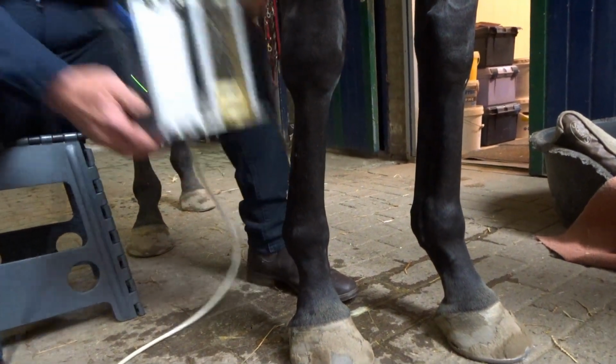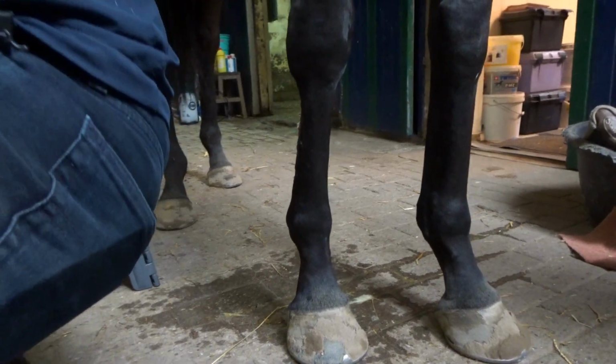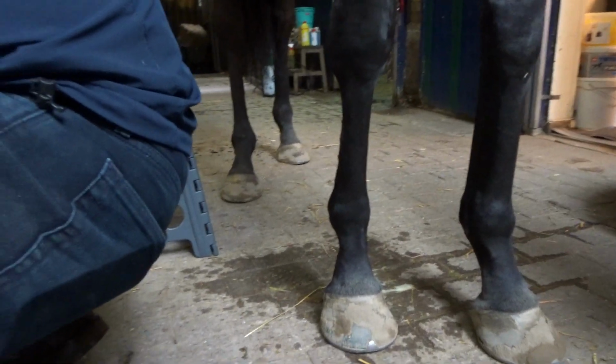And the horse has to stand completely still, Henk? Yeah, 40 seconds, no movement. Sounds short, but sometimes it's a very long time.